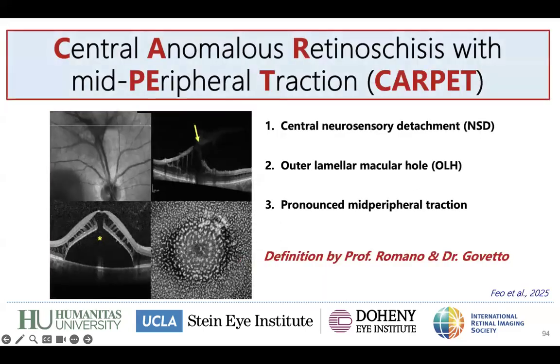Again, so this is the definition: central anomalous retinoschisis with mid-peripheral traction, or CARPET.